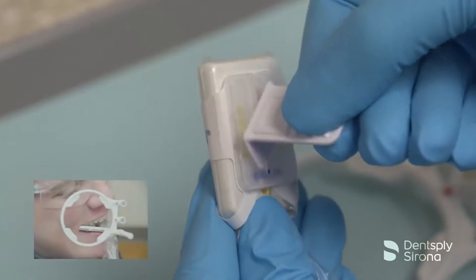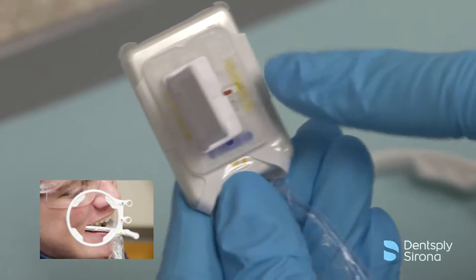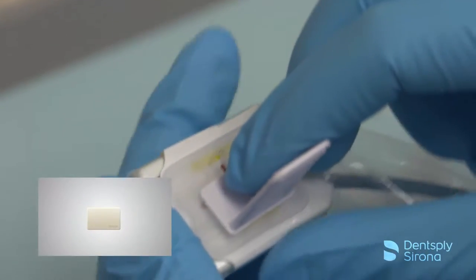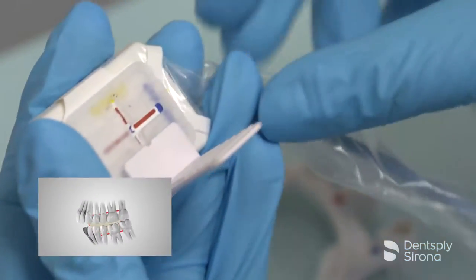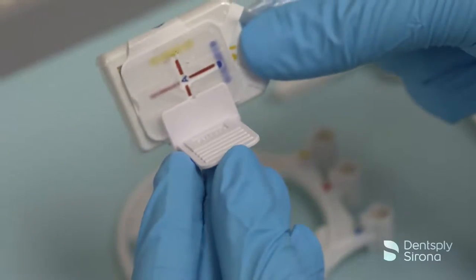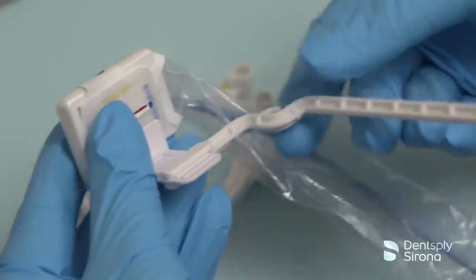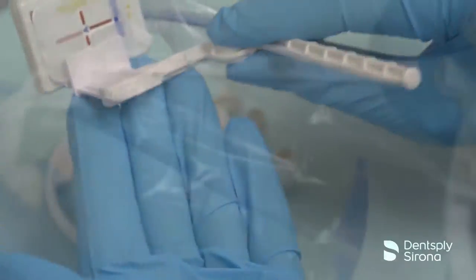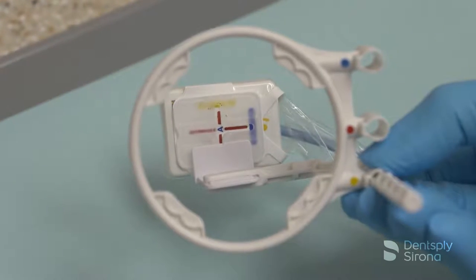For posterior images, slide the bite piece into the desired position as indicated by the yellow lines. Center the bite piece with the sensor's active area. The bite piece allows for a wide range of adjustment as needed to accommodate the patient's presentation. After adjusting the bite piece, position the ring on the yellow indicator hole, flipping the ring around to accommodate an upper or a lower posterior image.